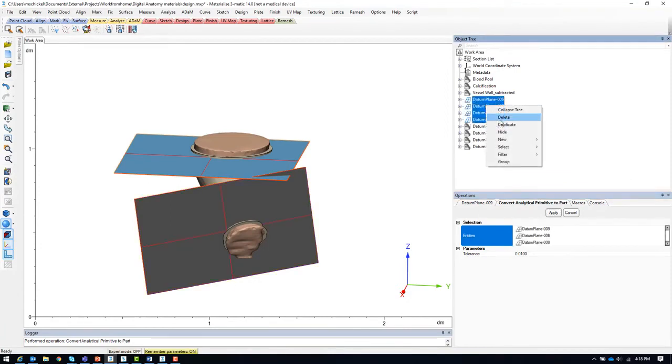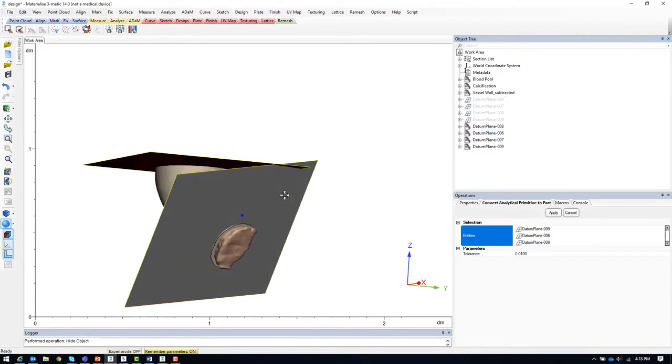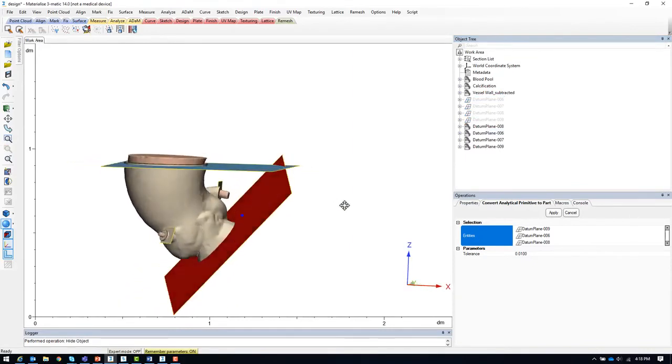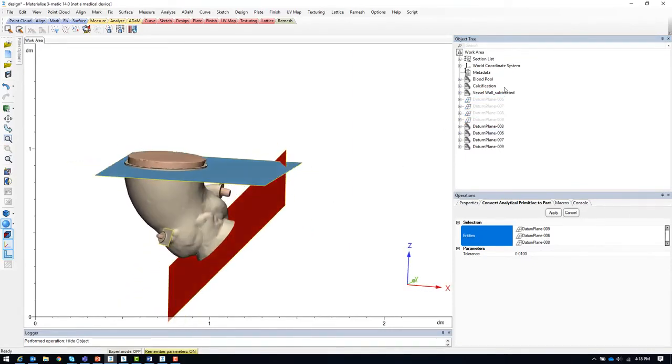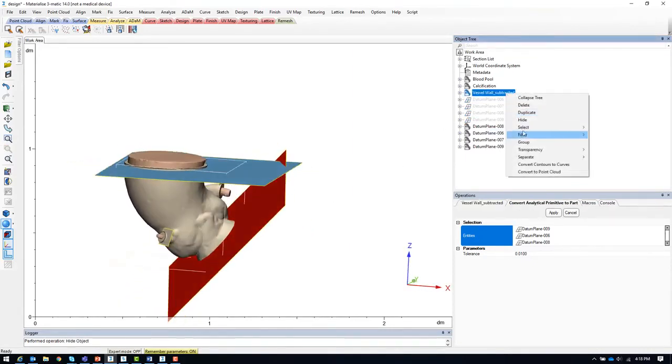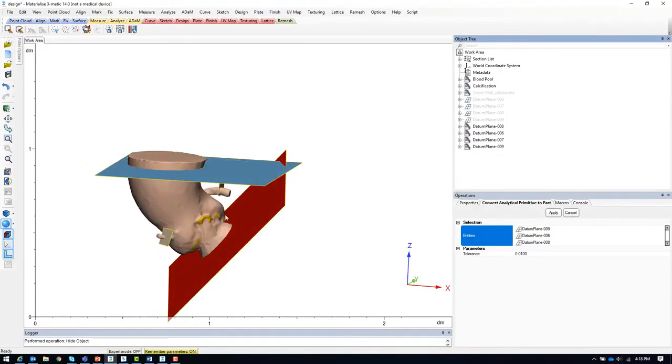Hiding the analytical datum planes, we can see we have our final parts and they should not intersect with our blood pool model.